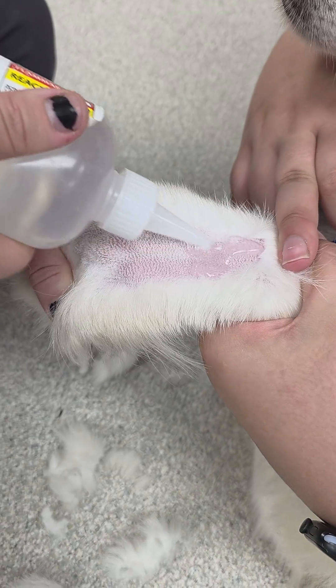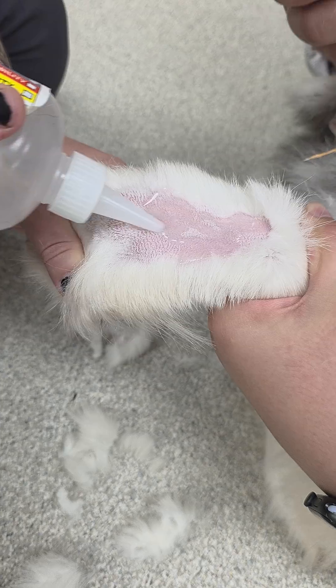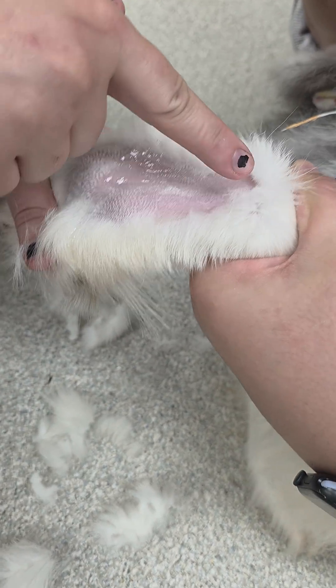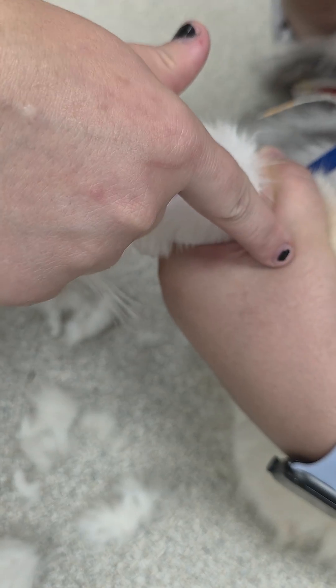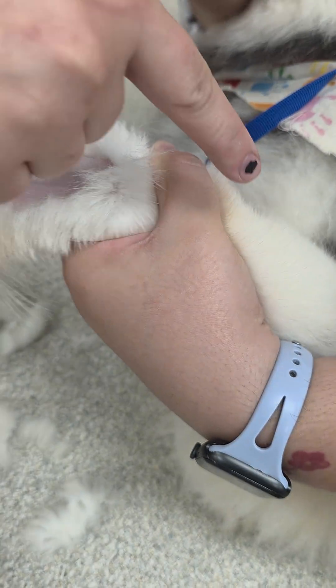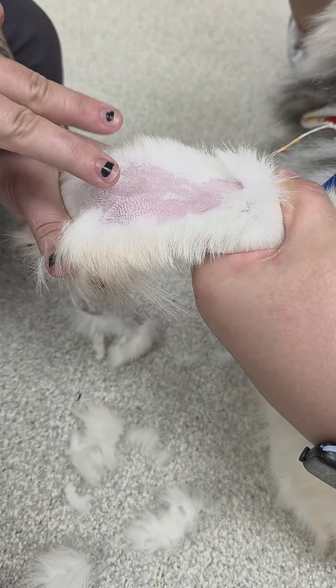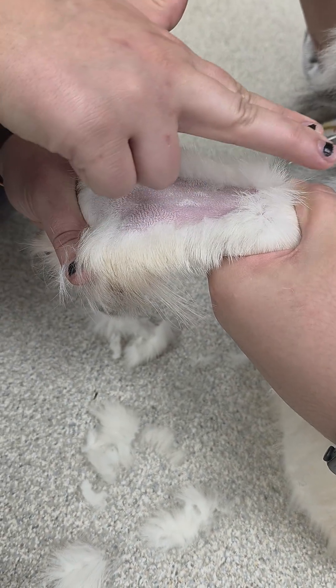As I put alcohol on it, it'll pop up a little bit more. You can see the vein flow — this is where it goes into the accessory of the cephalic vein and then wraps around. But it starts off here where it has two, and then it goes to one.